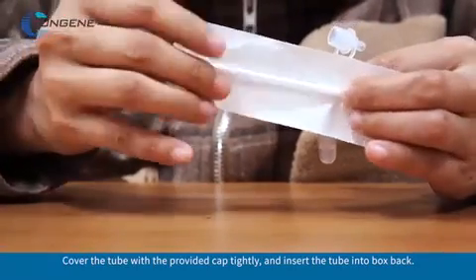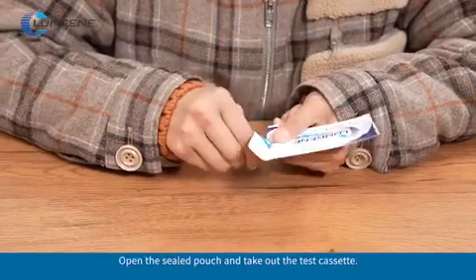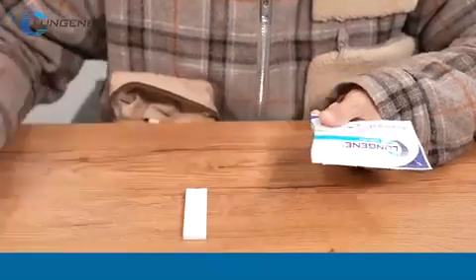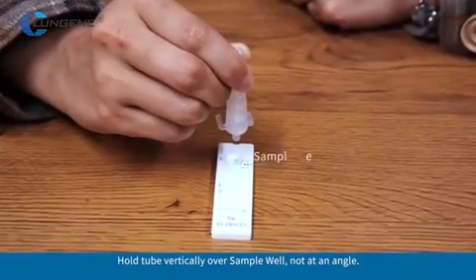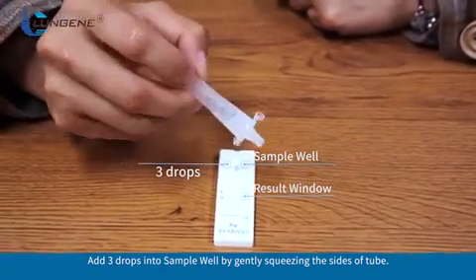Cover the tube with the provided cap tightly and insert the tube into the box back. Open the sealed pouch and take out the test cassette. Hold the tube vertically over the sample well, not at an angle. Add 3 drops into the sample well by gently squeezing the sides of the tube.